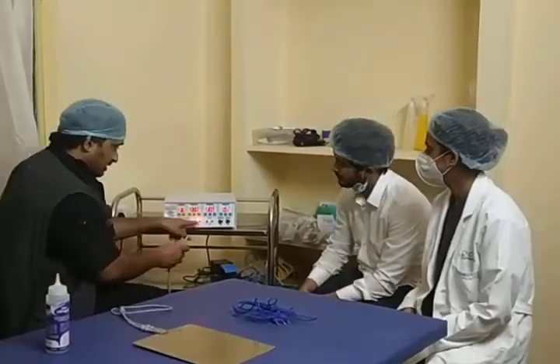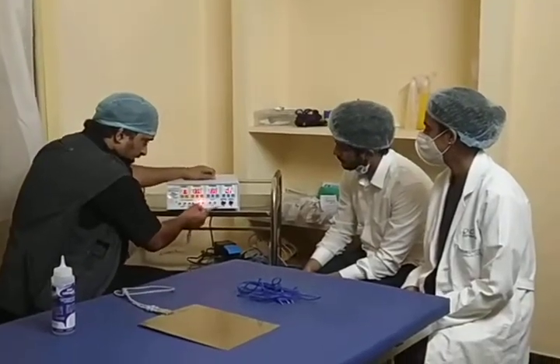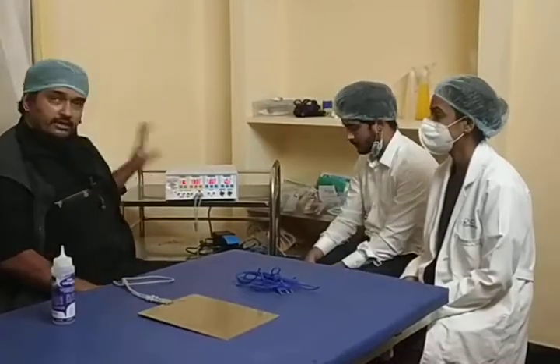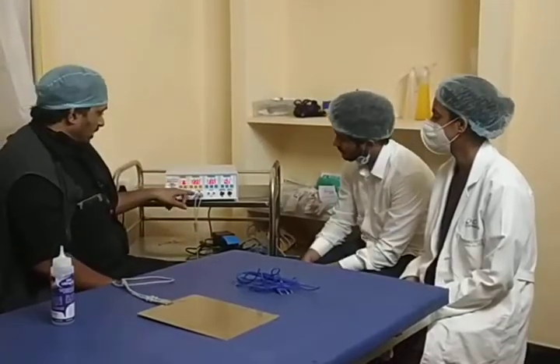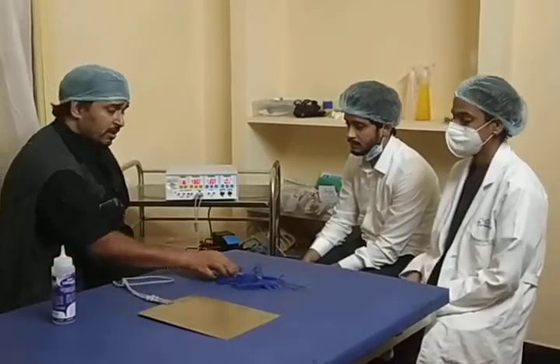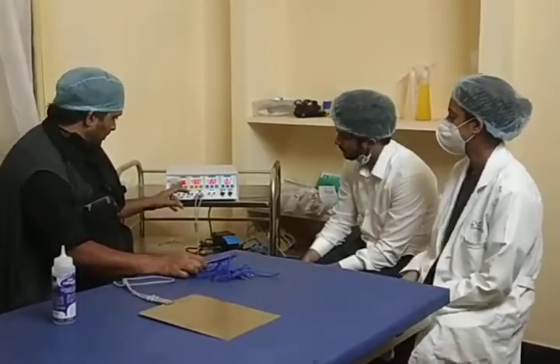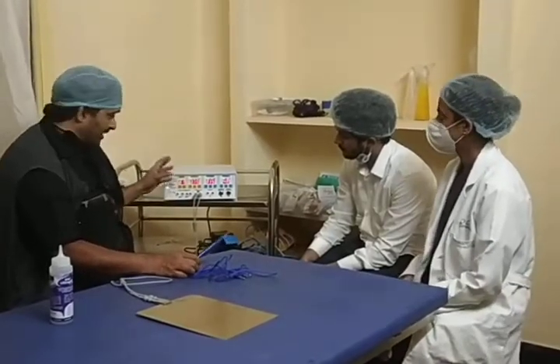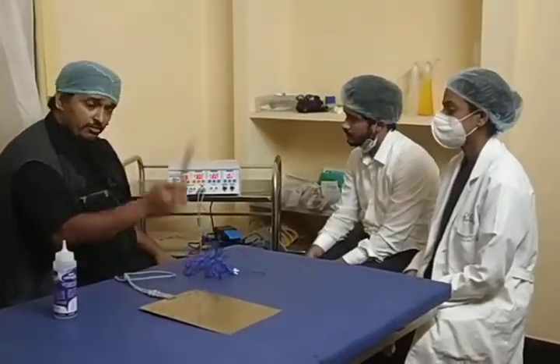And there is an instruction over here of patient plate. There is an indicator over here that is not connected at the moment. And the moment the indicator light has gone, okay, I have connected the patient plate over here, which is the source of earthing. Now we have a lot of options over here. There is a cut option, there is a coag option, there is a unipolar option, and there is a bipolar option, there is a hand operated switch option and a foot operated switch option.